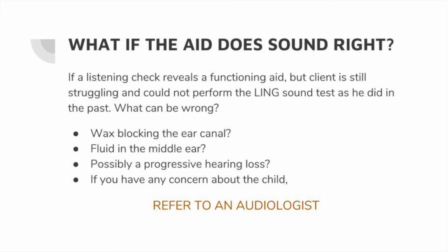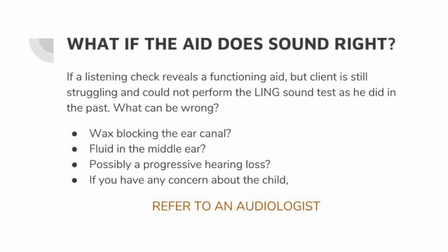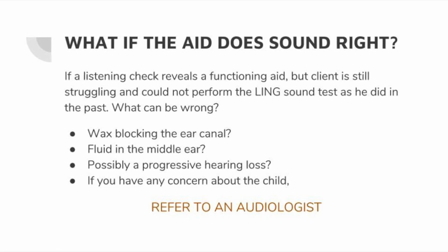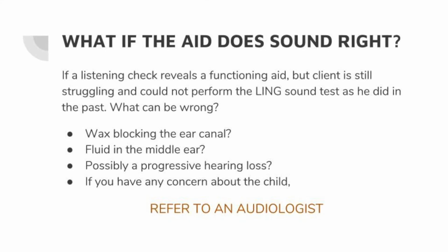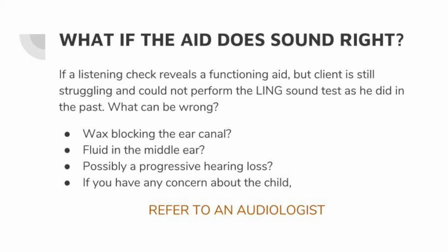So what happens if after your listening check you say, well, yes, that hearing aid sounds very good. I'm listening to the ling sounds. They all sound crisp and clear. Everything is clean. The battery's working. The hearing aid is turned on. So the hearing aid sounds right, yet the child is still responding as if he's not hearing sound.